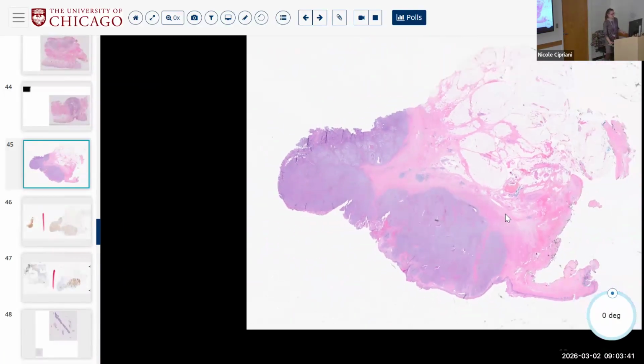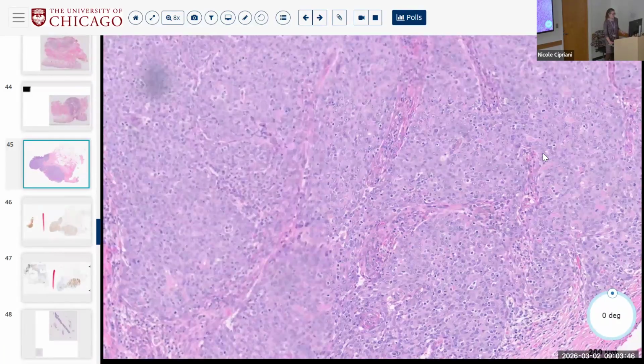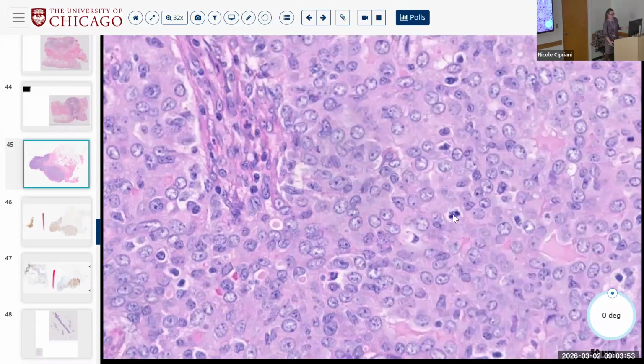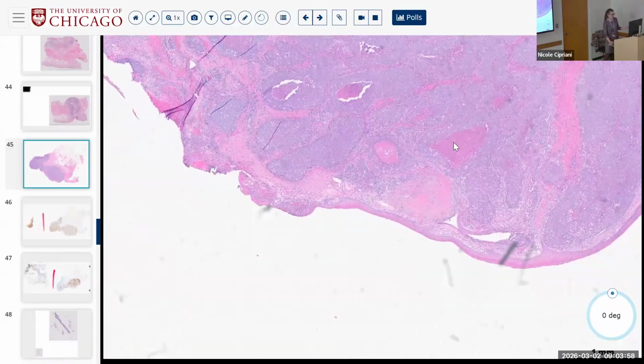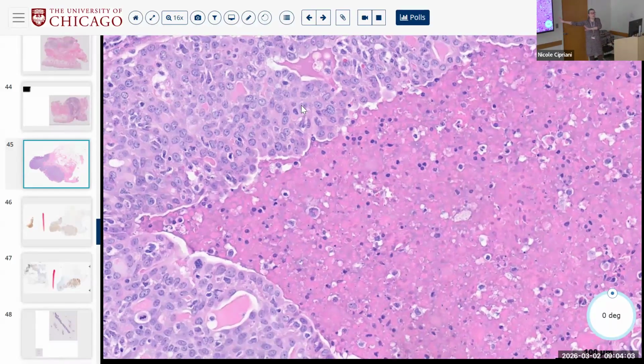All right, so this is a mucosal site with sheets, sheets of badness, mitotic figures, open coarse chromatin, necrosis, right? So now we are in the high-grade salivary carcinoma realm, right? Beyond that, what matters? Does it have a targetable mutation or fusion? Does it have anything that they can treat, right? You're calling this a high-grade carcinoma.